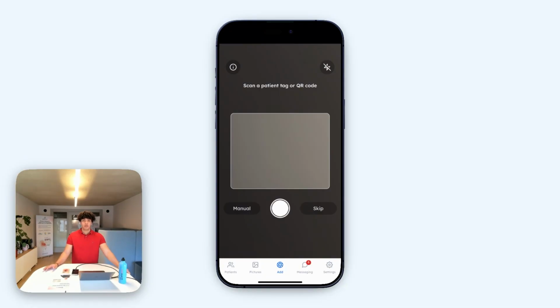So in less than 30 seconds, we were able to take pictures and videos and collect data through keywords, questionnaire answers, but also descriptions. All the data is stored in HDS servers, hébergeur de données de santé, health data host. But in addition, all the data is accessible in real time by members of your service or by colleagues at the establishment level. So now I will be showing the rest of the application.